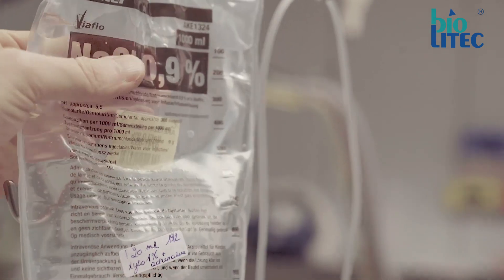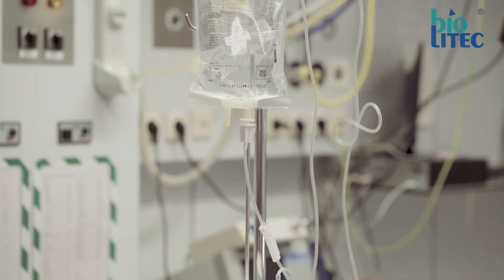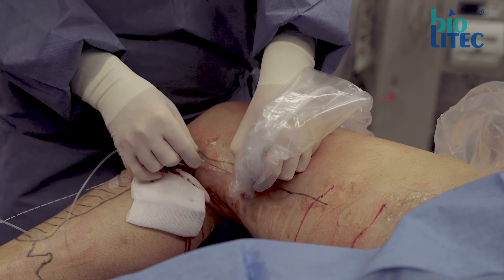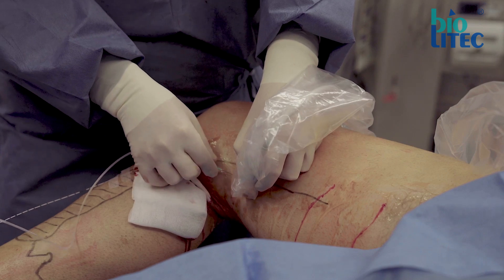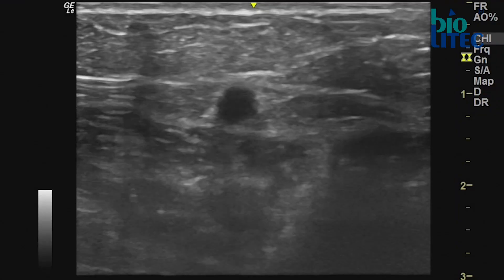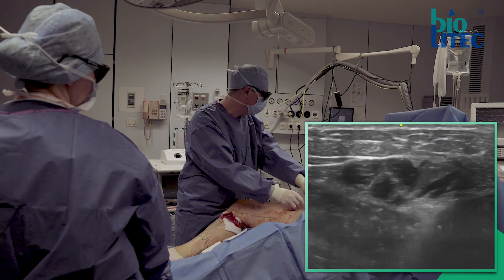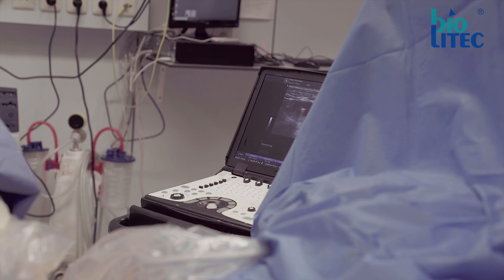We use saline as a tumescent and add one vial of xylocaine with adrenaline. This is beneficial for postoperative pain control and improves interaction of the laser with the vessel wall by inducing vasospasm. The tumescent is injected from distally to proximally. Looking for a retroacoustic shadow can help to localize the laser catheter, and moving the needle a little helps visualize its tip. Try to inject the saline nicely within the saphenous sheath — there is absolutely no need to infiltrate the subcutaneous tissue with vast amounts of fluid.